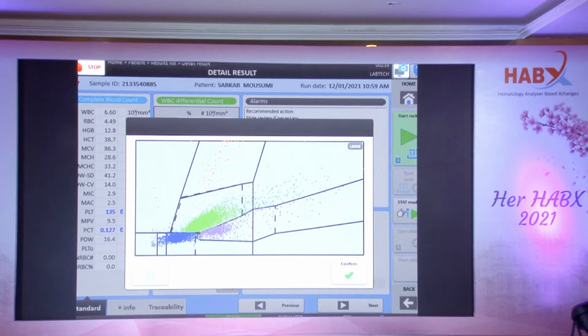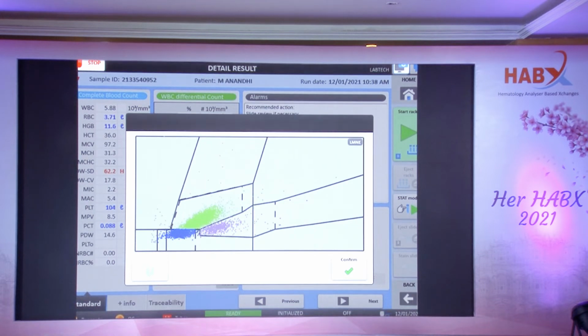The monocytes are merging with the neutrophils. So this cell counter can pick up large neutrophils, can pick up neutrophils which have got low scatter, and will pick up neutrophils which have got merger with the monocytes, which will cause pseudomonocytosis. Yes, this cell counter can also pick up sepsis. Some more cases. This is another case. You see the monocytes and neutrophils hugging each other, pseudomonocytosis.